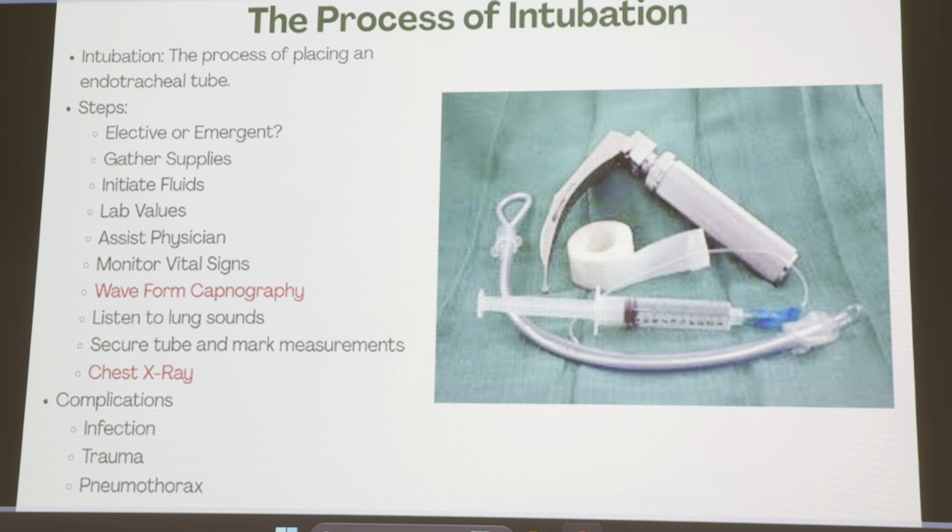Lung sounds, right? You're kind of the workhorse. Yes, you're task forcing. If they need anything, need you to grab anything, you're monitoring their vital signs. So you're looking up at that bedside monitor, making sure our heart rate doesn't slow down. Our BP doesn't plummet all of a sudden because we're giving them these big sedatives and these muscle relaxants. Our blood pressure is going to take a hit at some point.